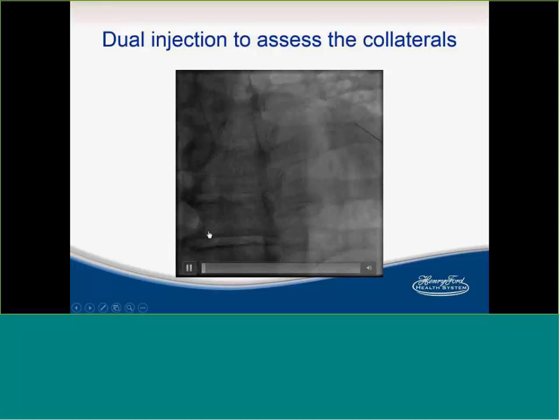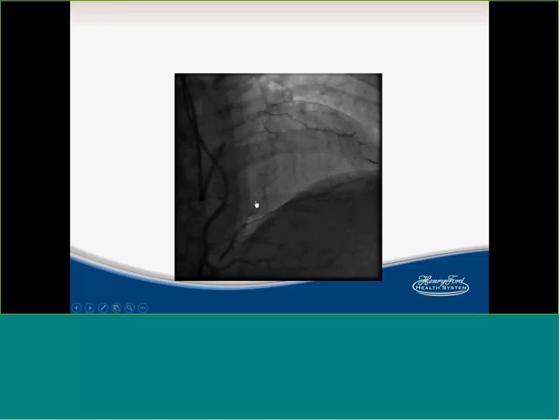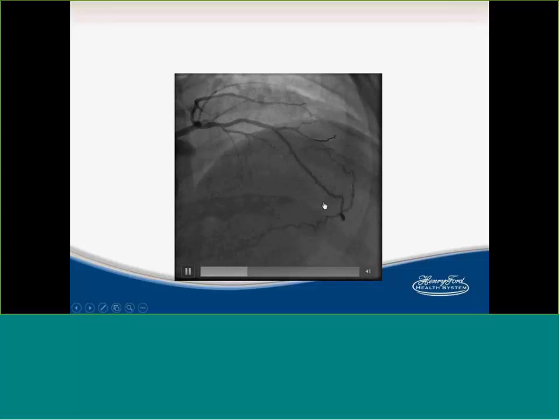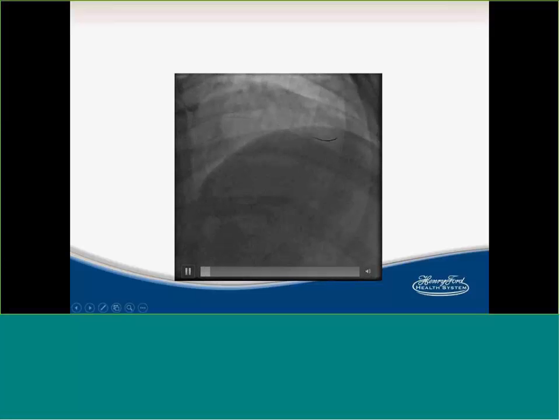So if you remember, if you have the distal occlusion cap at a bifurcation and you end up dissecting antegradely, the dissection plane normally goes along one of the branches. Normally it does not track both branches. And I want you to watch in here at the end of the... Sorry, I'm going to have to remove this. I'm going to play it again. I want you to watch in here.